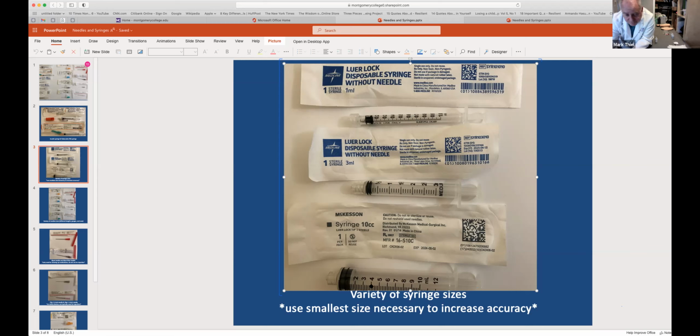Then this one, the 10 ml, you may use this. This is a good utility syringe for many other things, to draw samples, for example. But probably unlikely unless you have to give perhaps 3 or 4 mLs, which is a whopper of a dosage. And you have to give that, right? 10 ml.